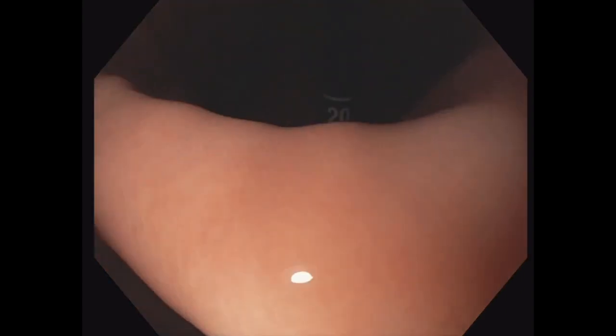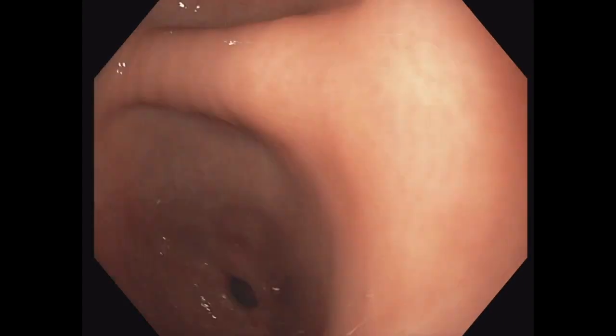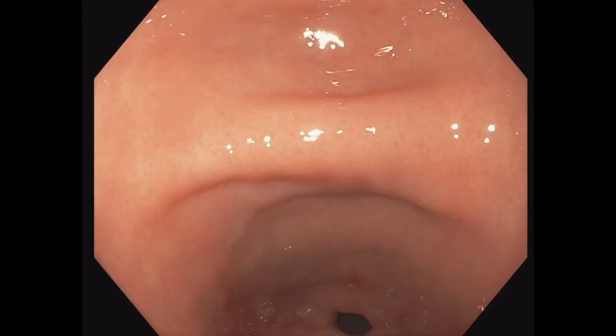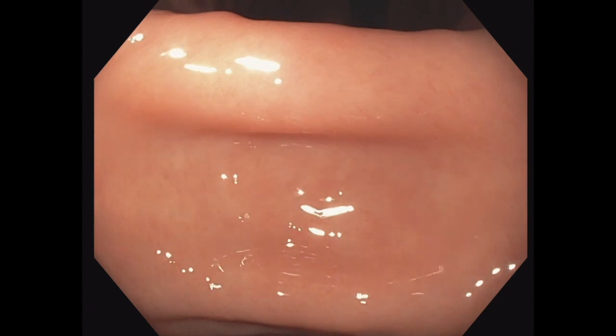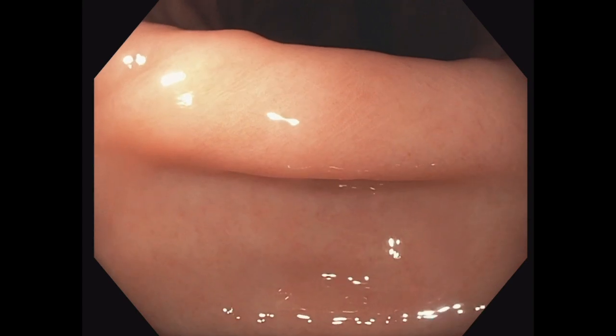Passing the pylorus can trigger gastric peristalsis, so I prefer to observe whole stomach first, but it is just a preference. The gastric angulus, also known as incisura, is common area for abnormality also, such as ulcer and cancer, so be cautious.